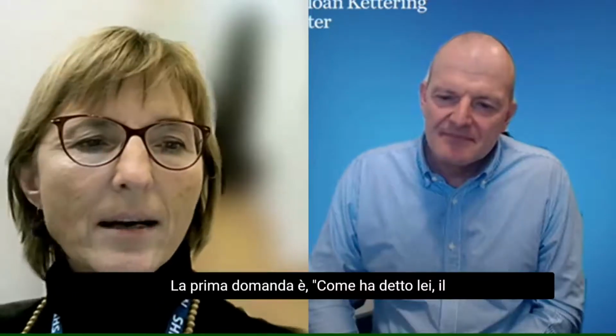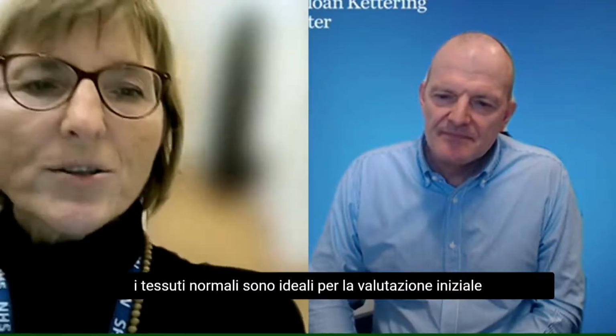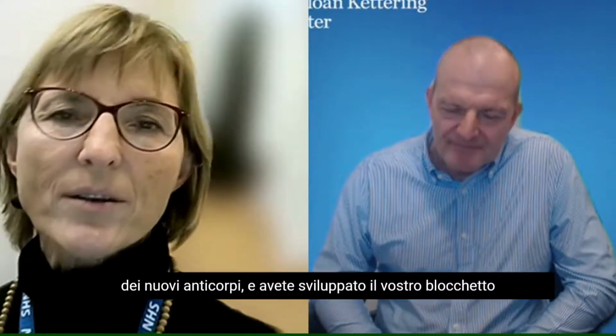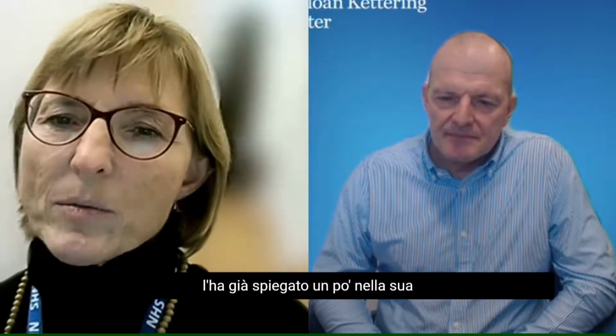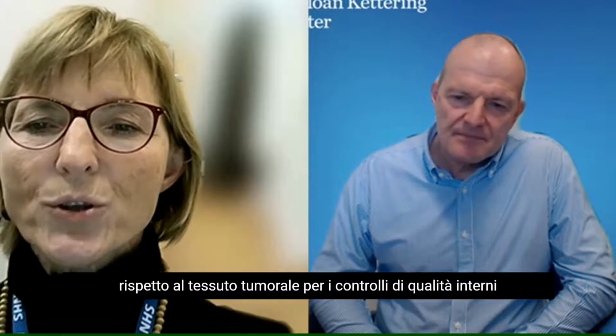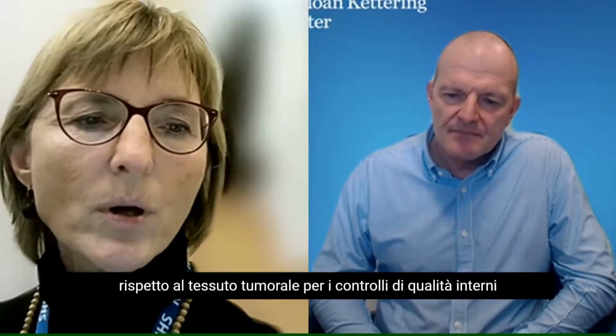The first question is, as you said, the normal tissues are ideal for initial testing of the antibodies, and you have developed your multi-tissue block for this purpose. You explained it a little bit in your presentation, but I want you to stress it. What are the reasons to prefer normal tissue over tumor tissue as internal quality controls for routine immunohistochemistry testing?